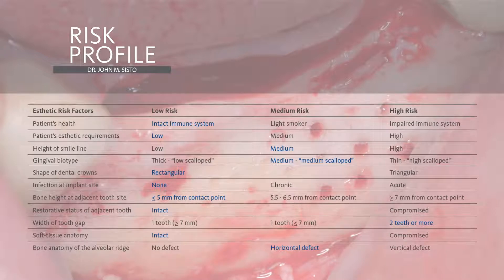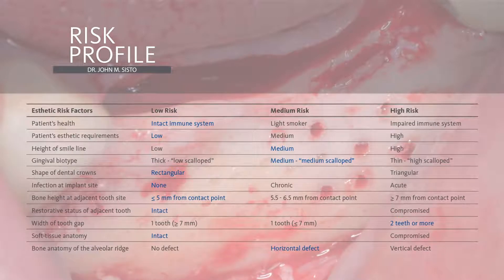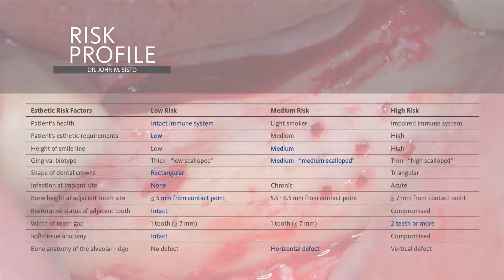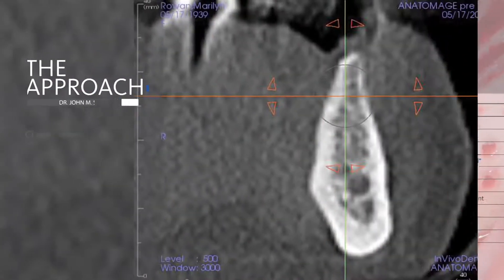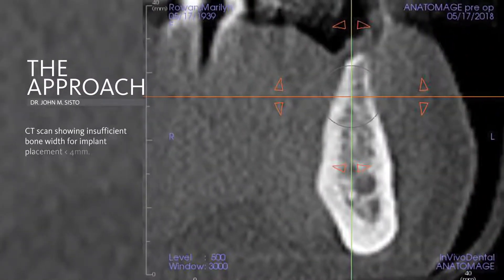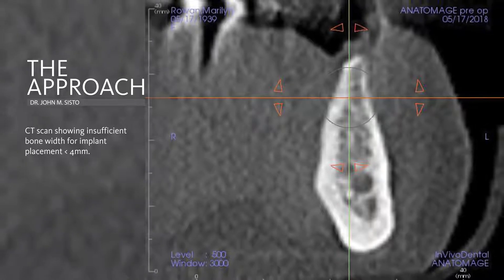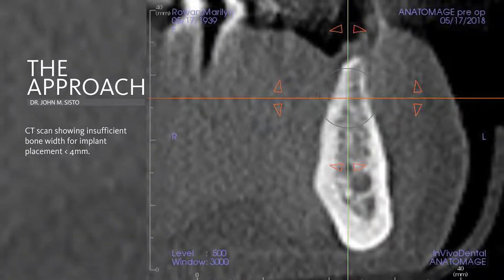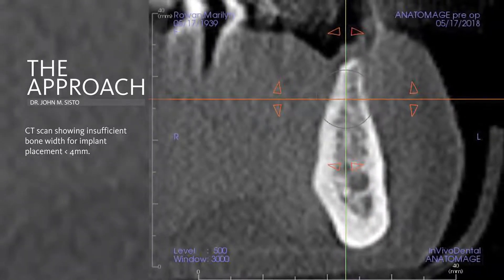The augmentation requires meticulous dissection and gentle handling of the soft tissue. A preoperative cone-beam CT scan revealed ridge width less than four millimeters in the coronal third of the ridge.